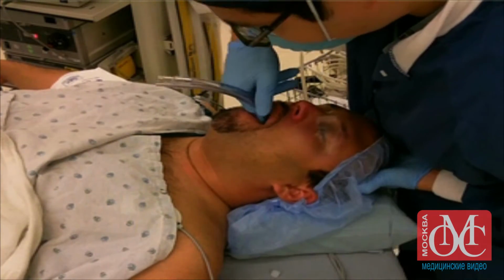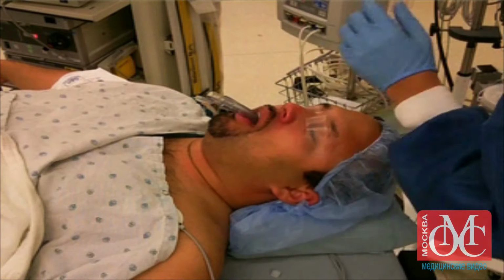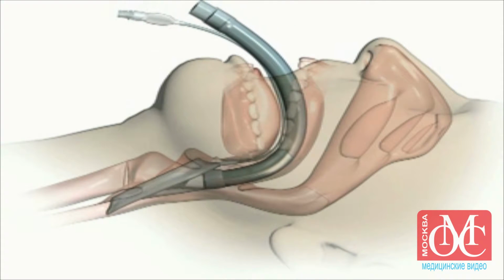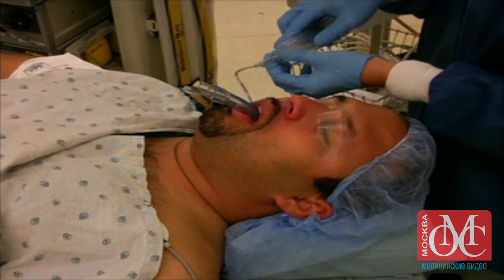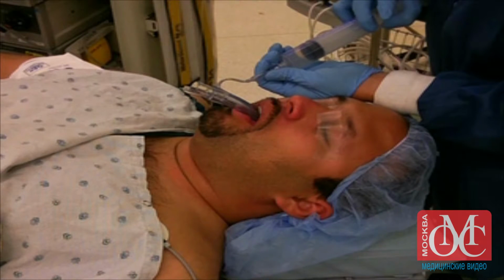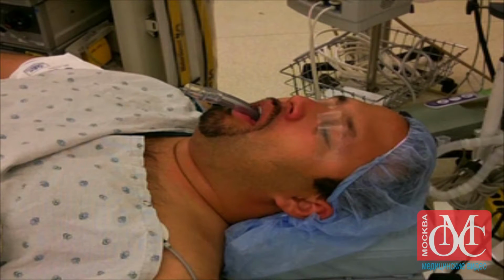Continue with this motion until you feel the tube's cuff pass behind the tongue completely, and then until you meet resistance. Successful insertion depends on keeping the leading edge flat to prevent the cuff from folding on itself and exerting firm pressure against the hard palate during passage. Inflate the cuff with approximately 30 milliliters of air. During inflation, the shaft of the airway often moves out of the mouth 1 to 2 centimeters as it finds its proper location. The cuff should not be visible when the tube is in the proper position.